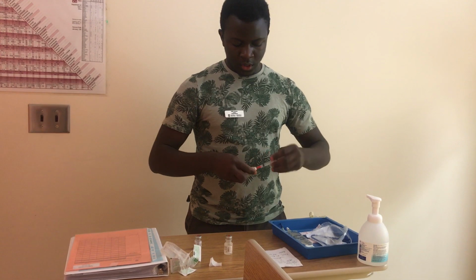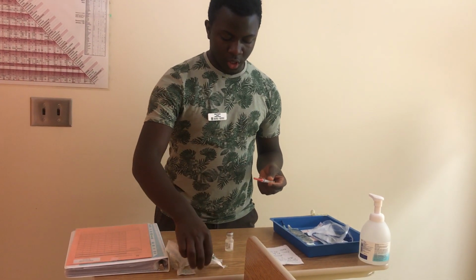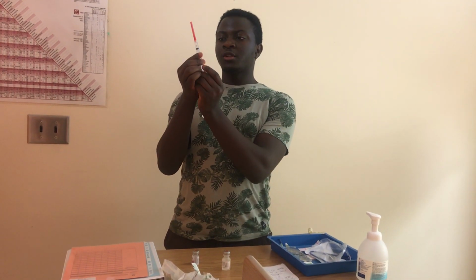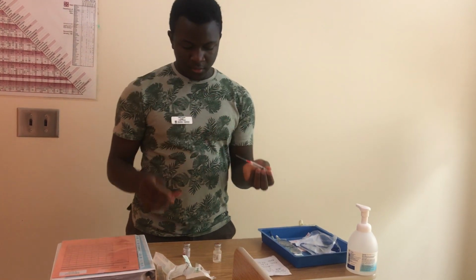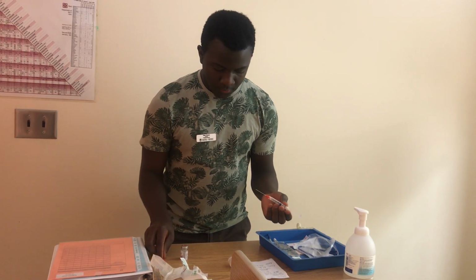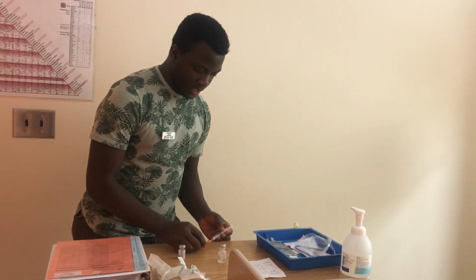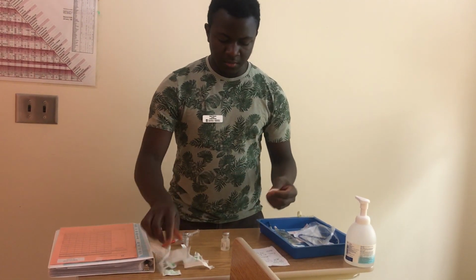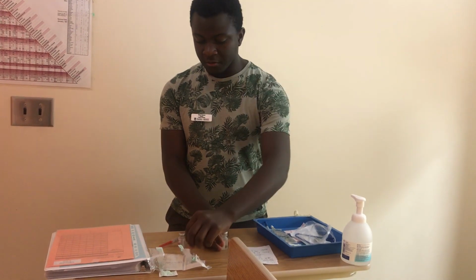I need 2 milliliters of sterile water to reconstitute my medication, so I'll first draw 2 milliliters of air into my syringe. I have 2 milliliters of air. Okay, and I'm going to tap it. For this reason, I will re-clean my valve because I fear that it might have been contaminated. I'll clean that again for 30 seconds and let it dry for 15.